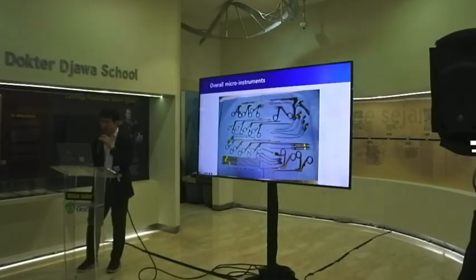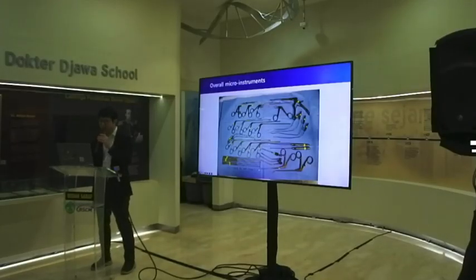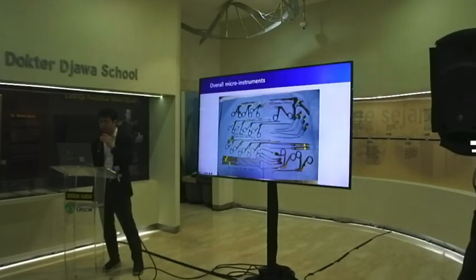So this slide provides a detailed breakdown of the various instruments in the transsphenoidal approach. They are set up at Seoul National University Hospital. They show the different types of micro instruments, including punches, suction tips, scissors, forceps, and more. This set is essential for performing precise endoscopic surgery.